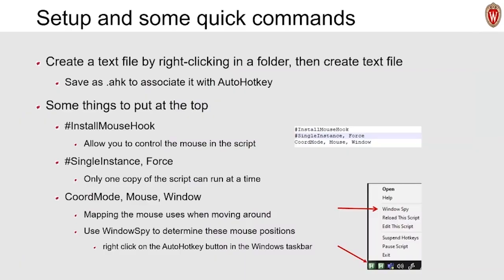All right, so let's look at AutoHotkey and using it with Unify data. We need to be able to move between samples easily and be able to put labels on a bunch of matches quickly. We can script those too. Keeping your hands on the keyboard and not mousing between samples is much faster. Not to mention that we can have it automatically go to the top of the list when it switches to the next sample. So let's look at building that AutoHotkey script.